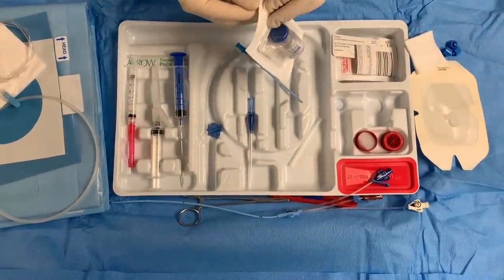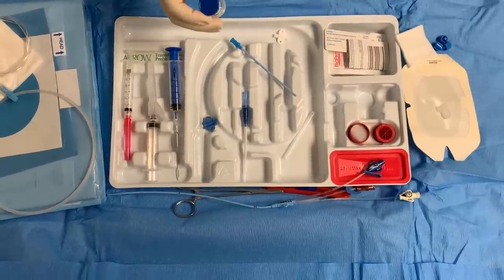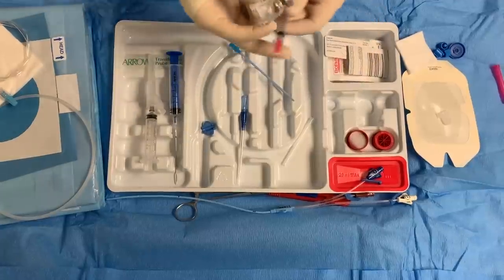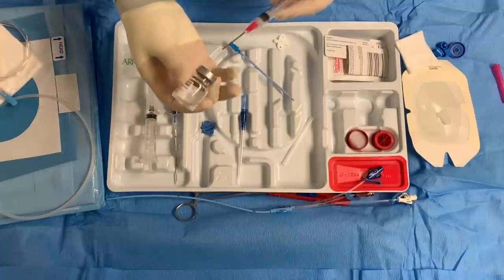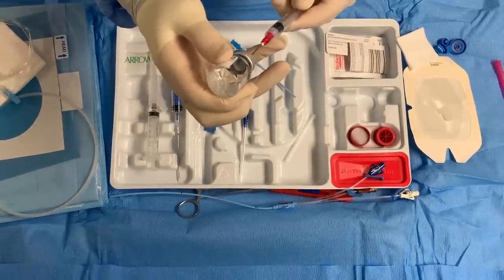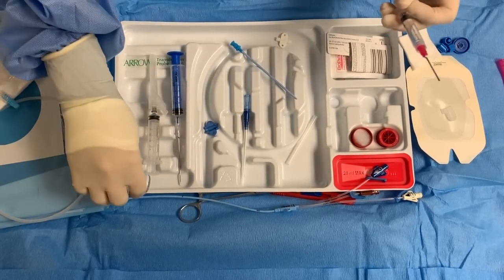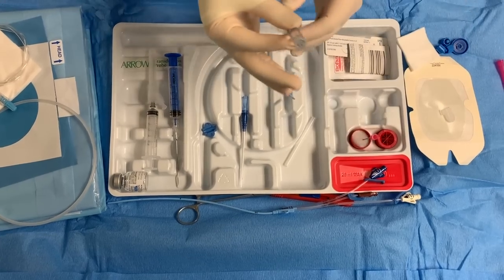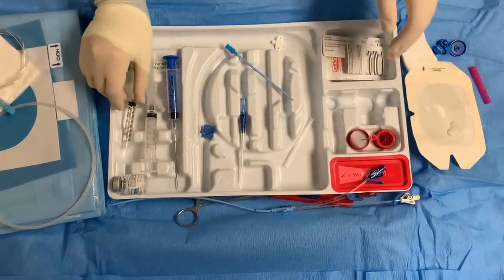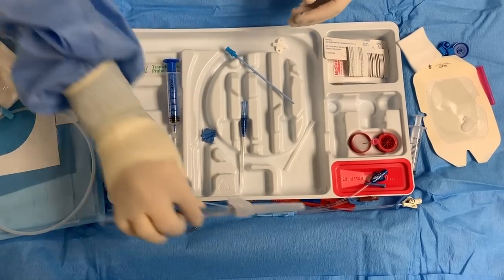We're going to draw up our lidocaine. You open up your lidocaine, pop this open. Take your syringe and put a little bit of air in, put this here. Hold it as tight as possible and the needle goes in — the hand needs to be as steady as possible. Take your needle and put it here. Now you have your lidocaine all drawn up. This is what's going to anesthetize the patient at that site.